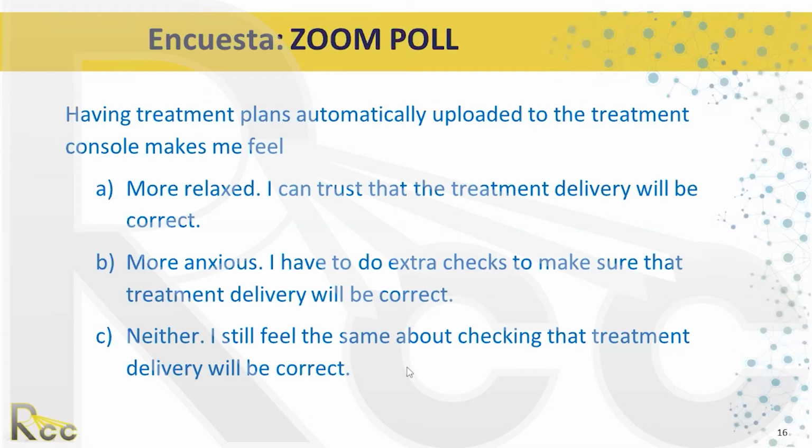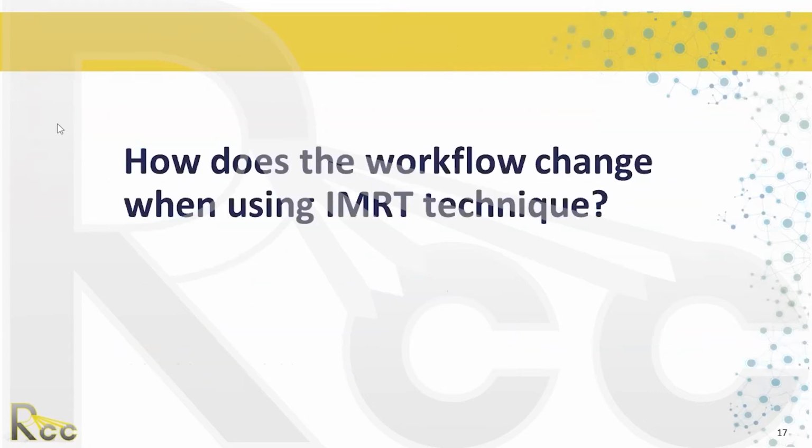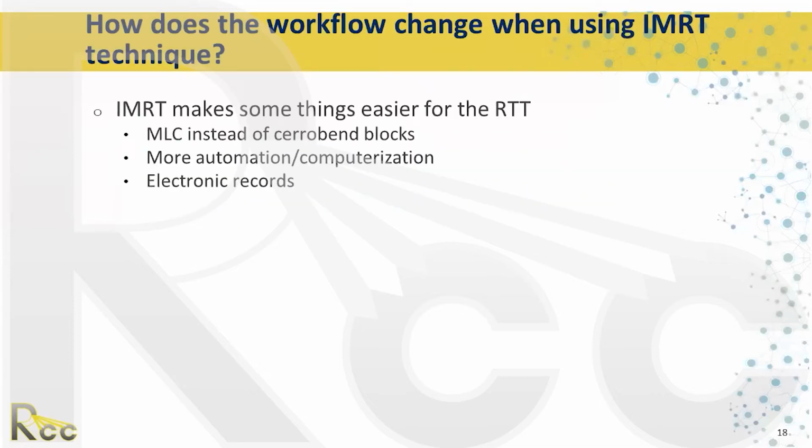Okay, going to move on to the next slide. Okay, so now we're just going to go over how the workflow changes using the IMRT technique. So there are many ways that IMRT actually makes our job easier. One of them is that we do not have to place lead blocks in the machine.